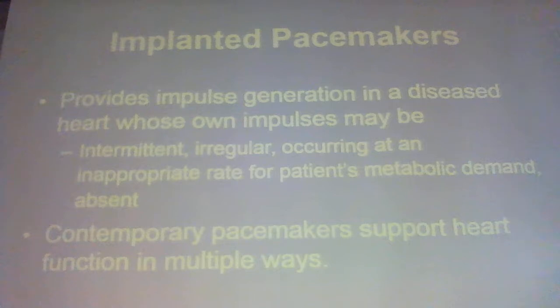This one tells you what the abbreviations stand for. And this one gives you examples of what they are. So basically, it tells you where it senses, if it's atrial or ventricular.